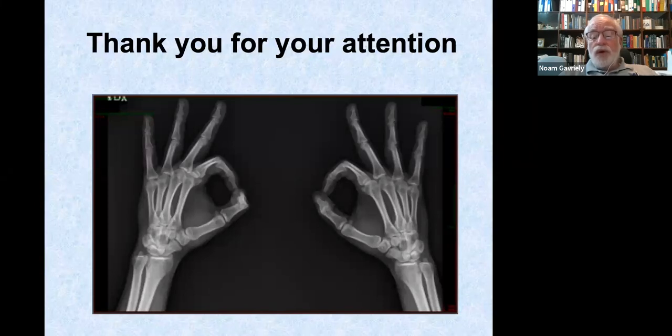For example, we do understand, but only recently, that putting HemaClear all the way up to the groin eliminates tourniquet pain.